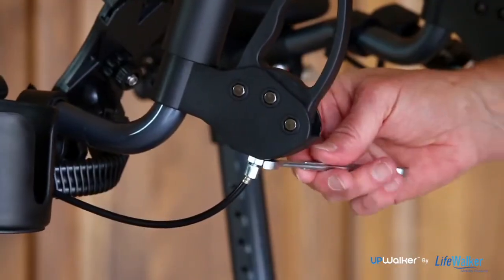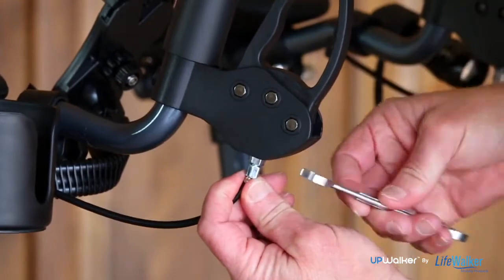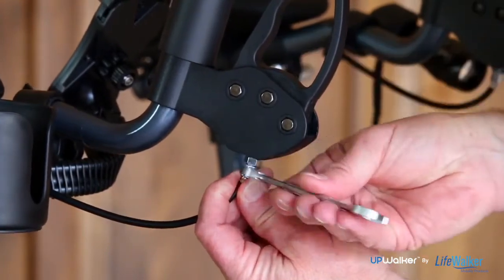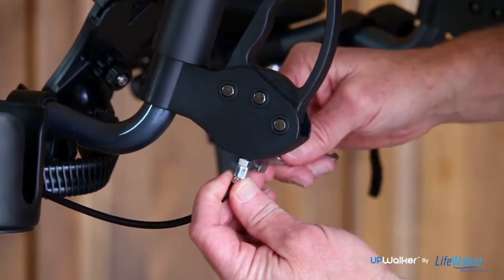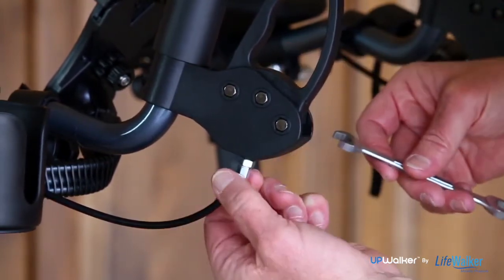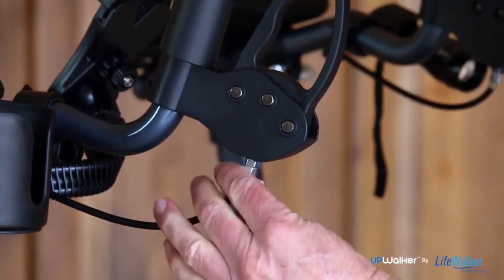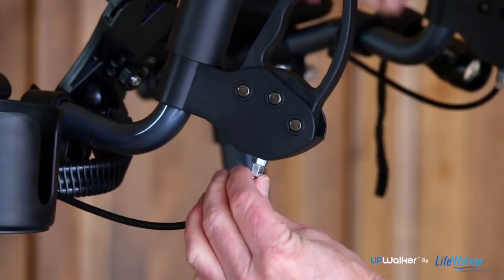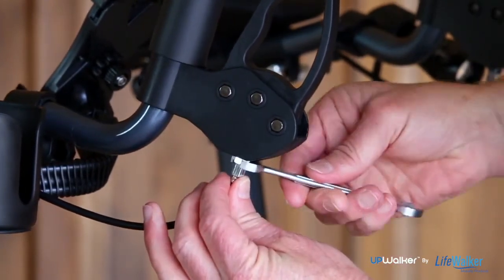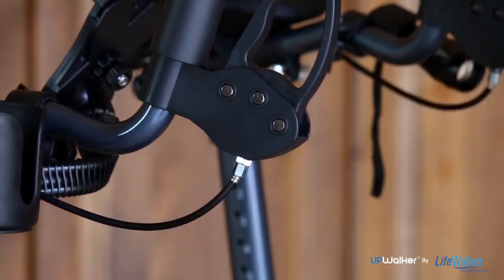If your brakes are too tight, use fingers or pliers to loosen the small adjustment screw using a 10mm or 13/32 wrench. Loosen the larger nut closest to the brake handle by turning it clockwise. If this does not correct the problem, repeat turning the adjustment screw a half rotation at a time until you have adjusted your brakes.